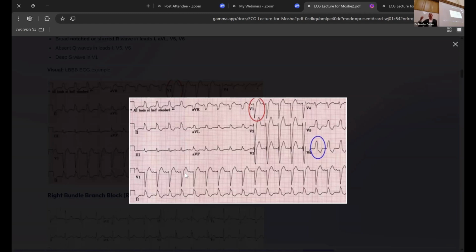So we say, okay, we have a tachycardia, we have sinus, because we found P waves. Again, look at V1, P QRS, P QRS, P QRS. So even though we have tachycardia, we can see a P before every QRS. So we have sinus rhythm, we have tachycardia, 110.